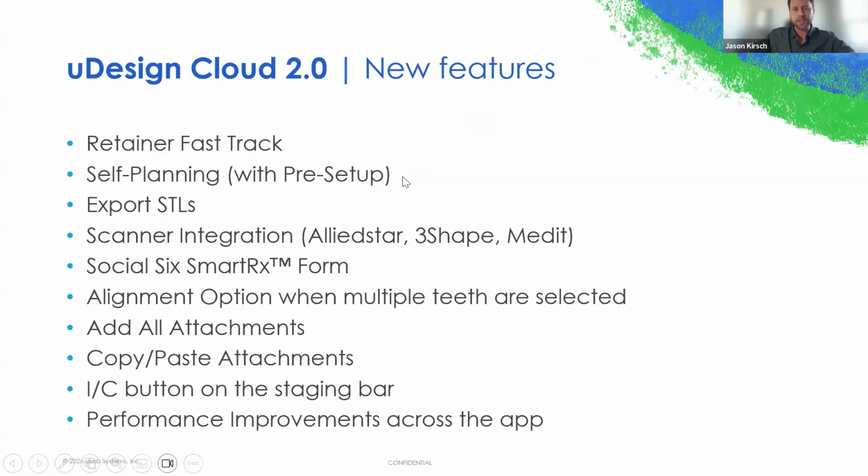I am one of the clinical software instructors here at uLab, and today we are going to cover the uDesign Cloud 2.0. Not sure if you've played around with this yet or not, but this is a great update. Normally they say the sequel is not as good as the original, but that is not the case at all with this latest update that we have.